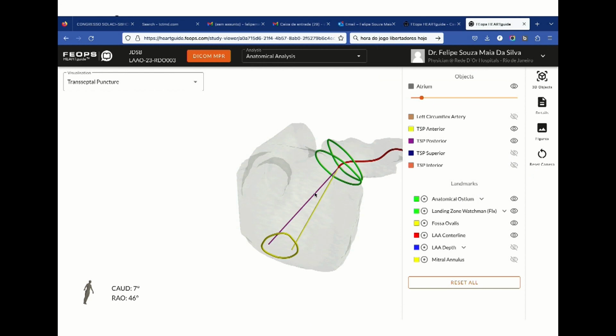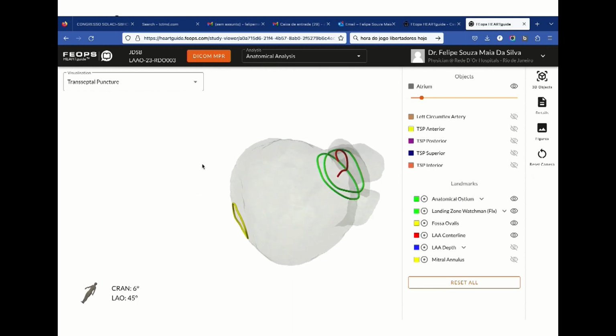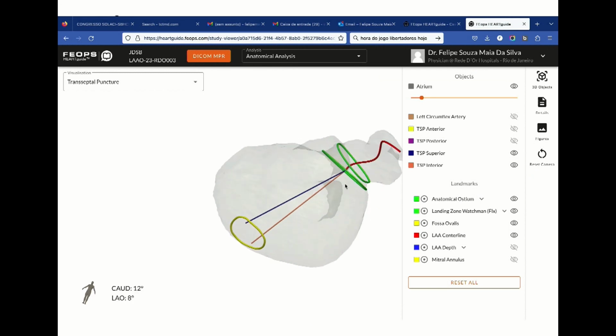So I think we can have Ole here who has described the technique for the transeptal puncture. Ole? Yeah, this is in an RAO 45-degree angulation, so that's to see whether the posterior or anterior puncture is the best. You saw that the posterior transeptal puncture would give the best coaxial alignment with the central axis of the left atrial appendage. This is now in an LAO view, so now we see the superior and the inferior aspect of the fossa, and you see also here an inferior transeptal puncture would give us the best coaxial alignment to cannulate really into the LA. So we're going to aim for an infero-posterior transeptal puncture, which is typically the best in 80-85% of all cases.